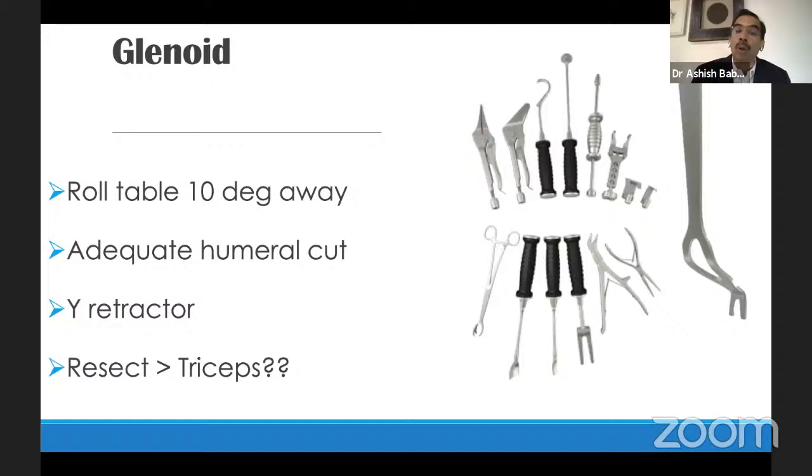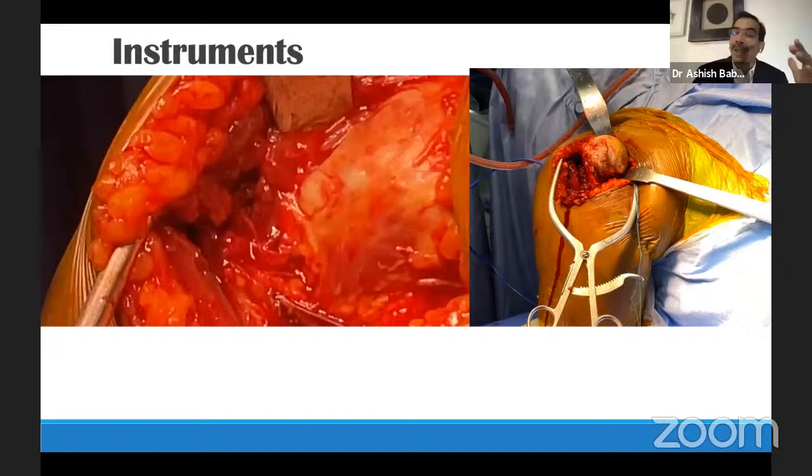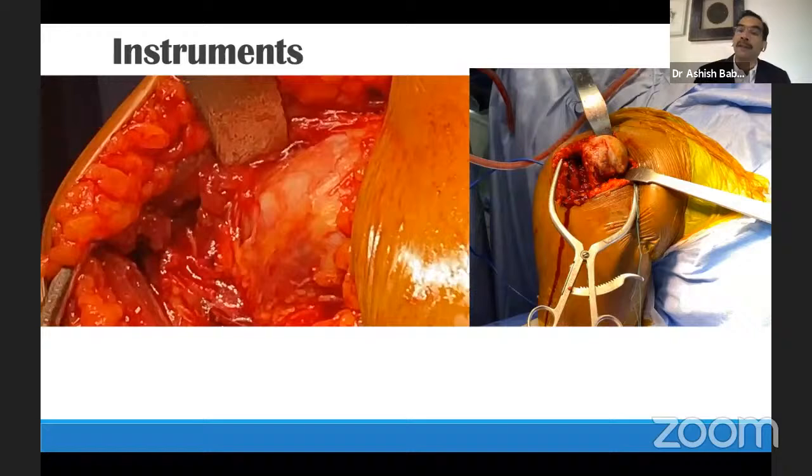So here you see the deltopectoral approach, and this is the blunt Hohmann that comes in. The reason it's blunt, it's a very broad tip, so it's not damaging the posterior cuff, and I can freely tension it, and that really opens up the book and allows the proximal humerus to herniate out of the wound, so you get a fantastic exposure.